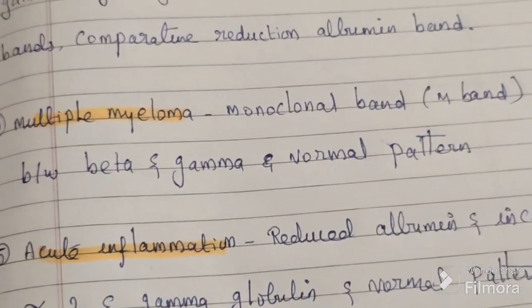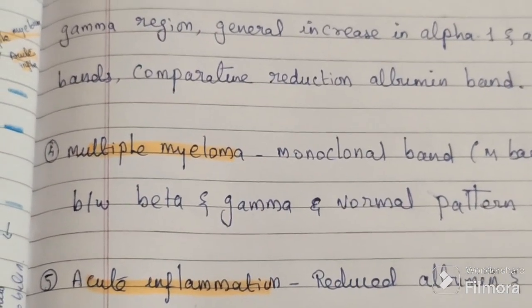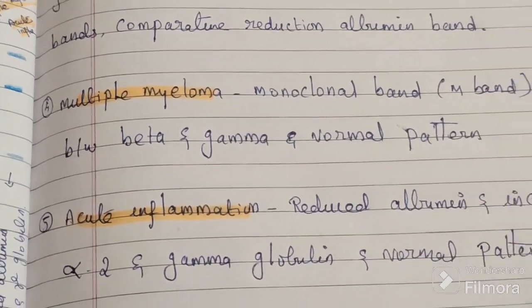So with the help of the normal pattern, the serum samples of patients with different clinical conditions are compared here.